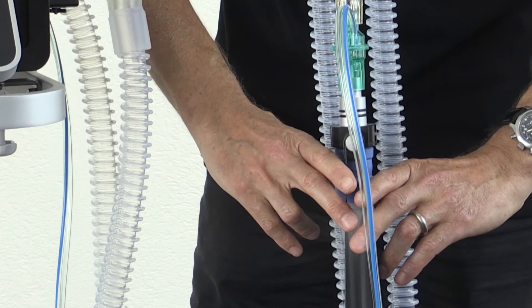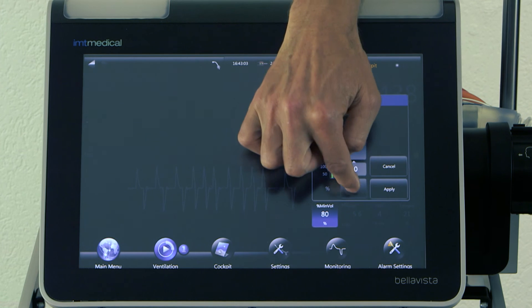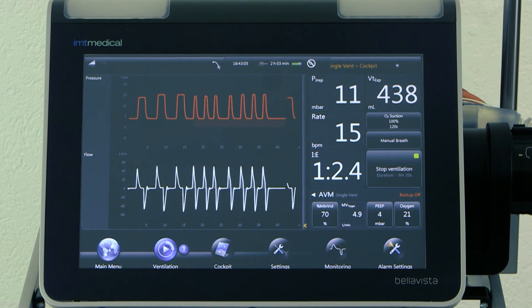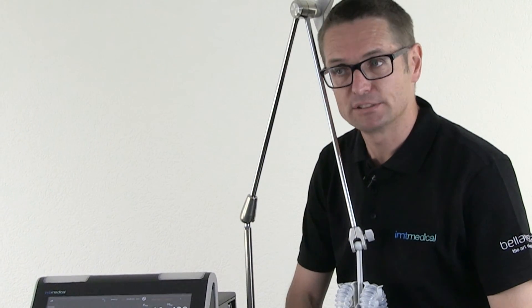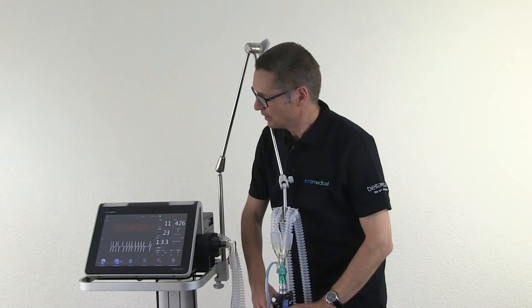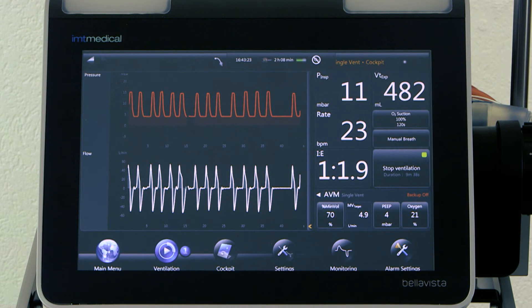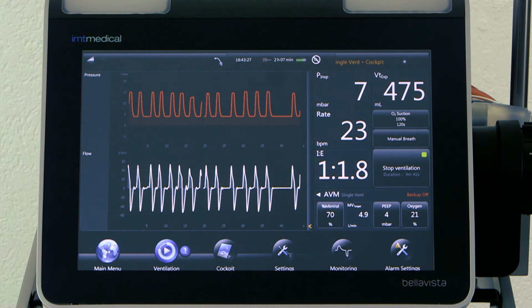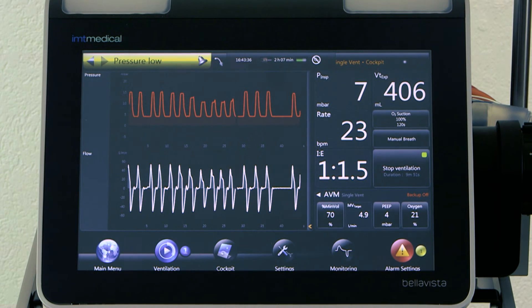If the patient is doing better and better, we can reduce even more — maybe to 70% — and the patient will be more motivated to breathe himself until he is ready to be extubated. We can see how the inspiratory pressure is going down to 9 millibar, to 7 millibar. This is how AVM works in the weaning situation.